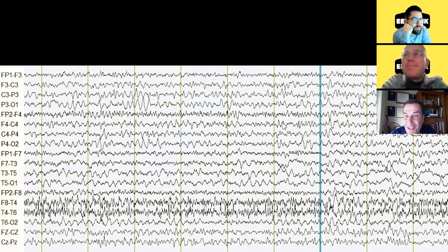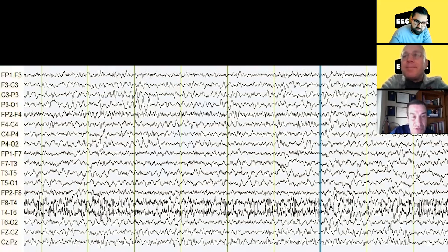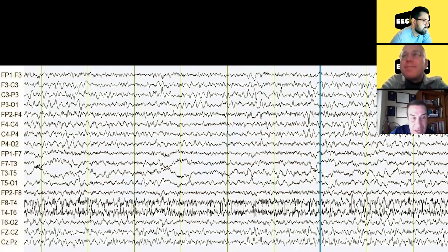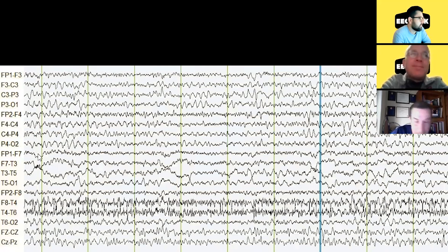Phase reversals do not indicate what the discharge is — they indicate only where the discharge is. So if we go through the record a little bit, I am sure I can find phase reversals of all kinds of things, including artifacts and normal rhythms. By the way, you can see this is a bipolar montage — the typical double banana, with central on top and temporal on the bottom.